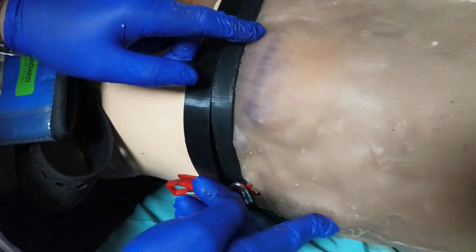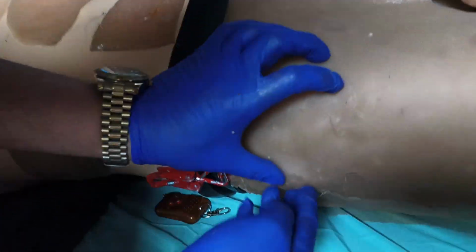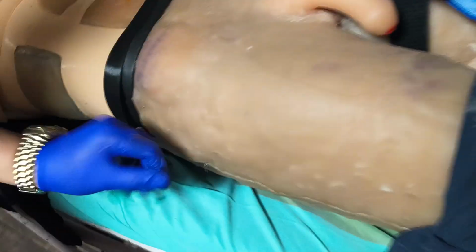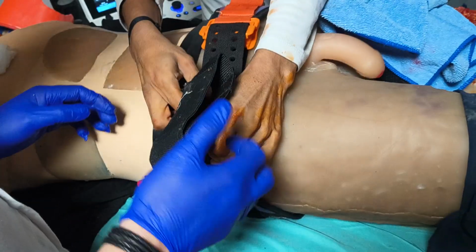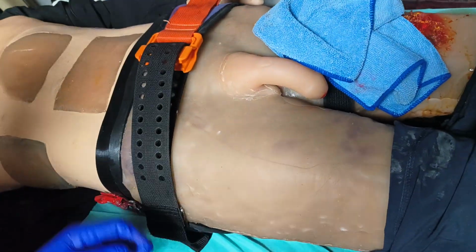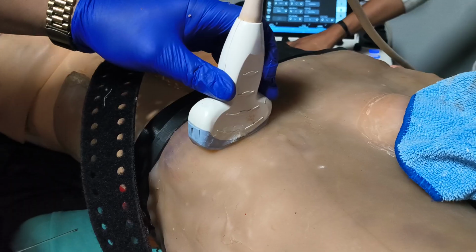Okay, these are the greater trochanters. We have marked the greater trochanter because the pelvic binder needs to be applied at the greater trochanter. So you have to come from below. Point is greater trochanter. Okay, of course you can use a bed sheet also. Okay, the block. That will complete our resuscitation.